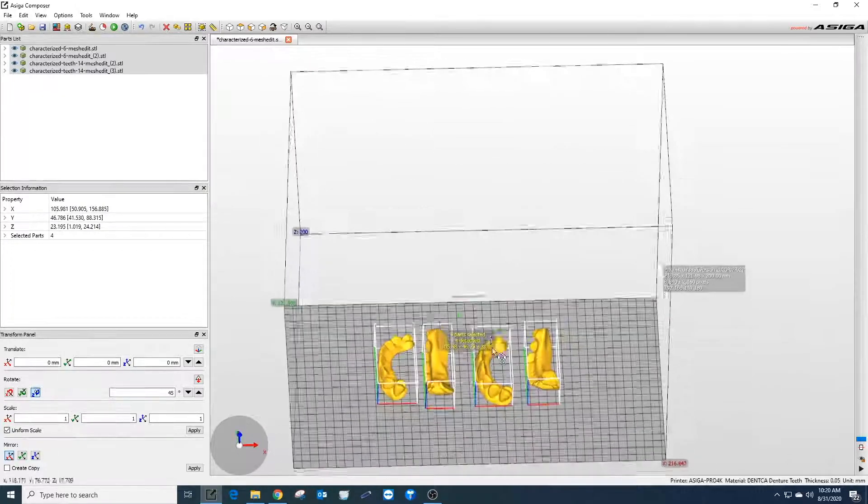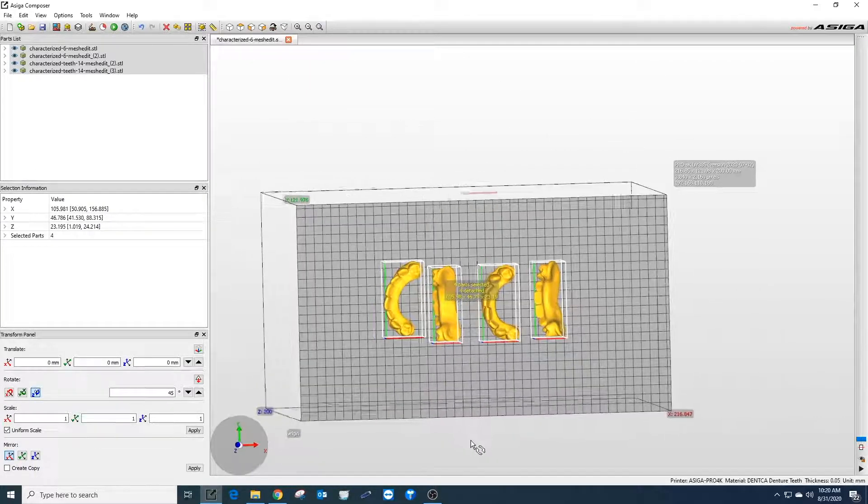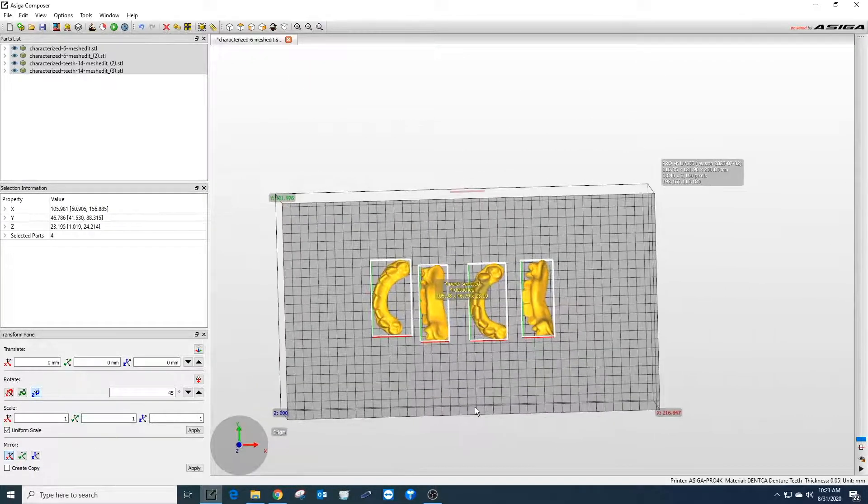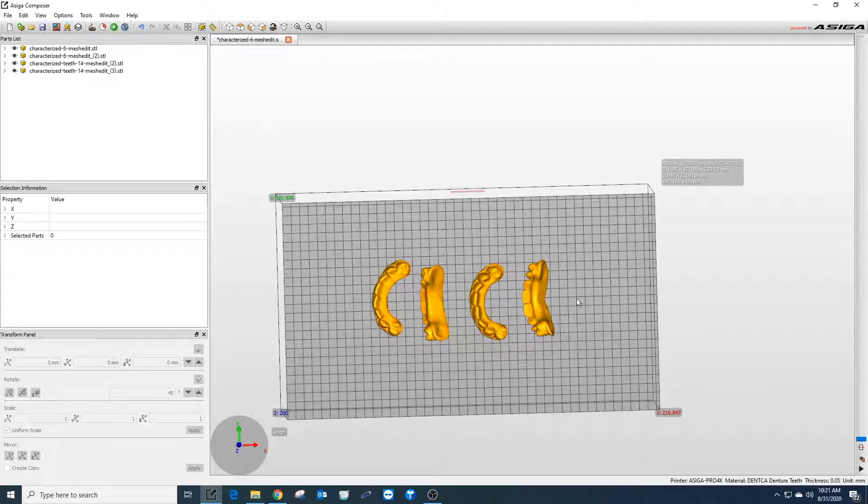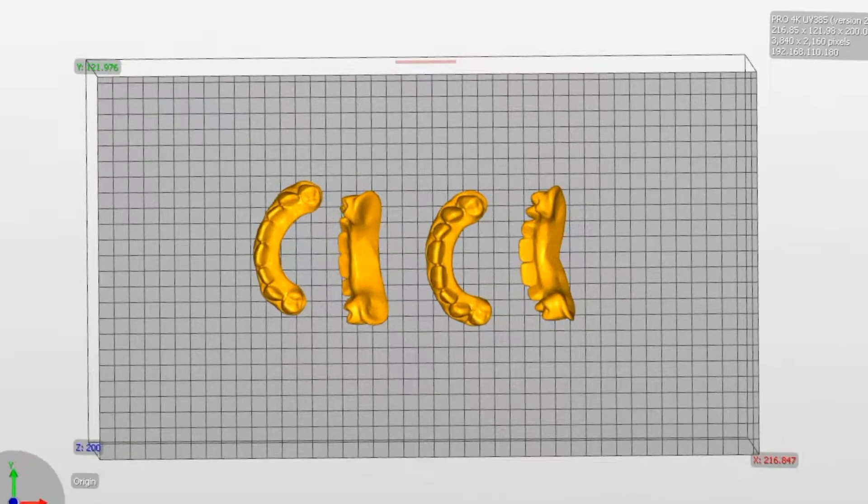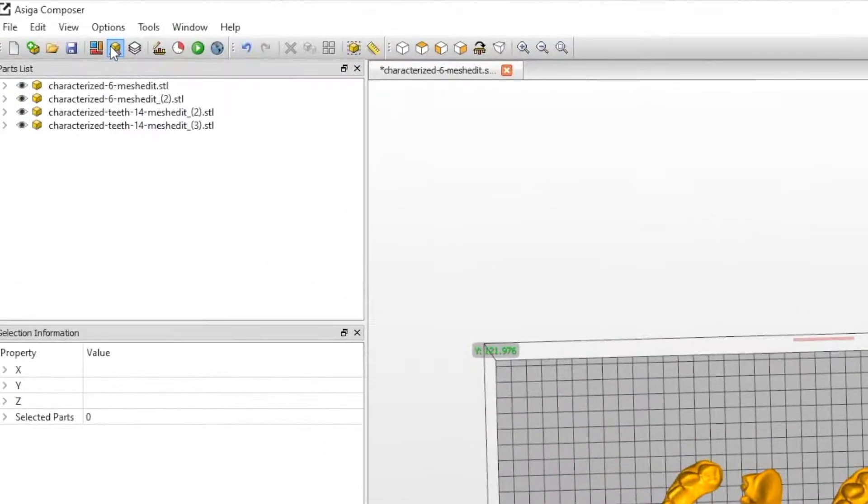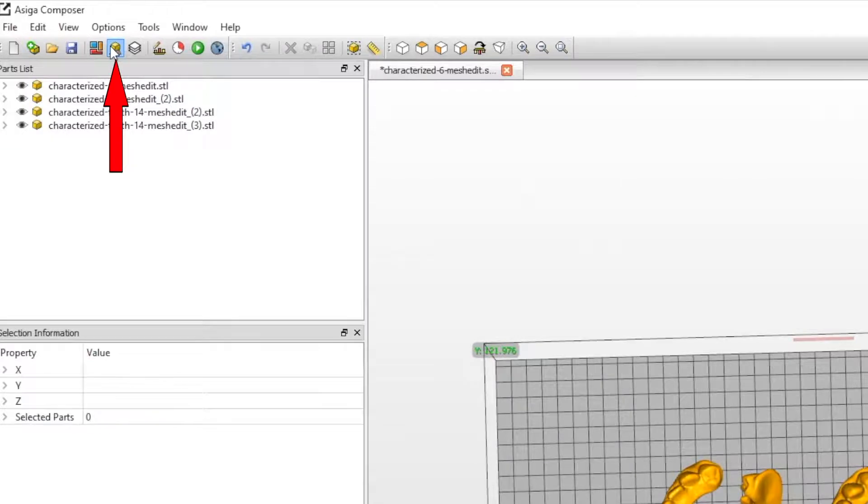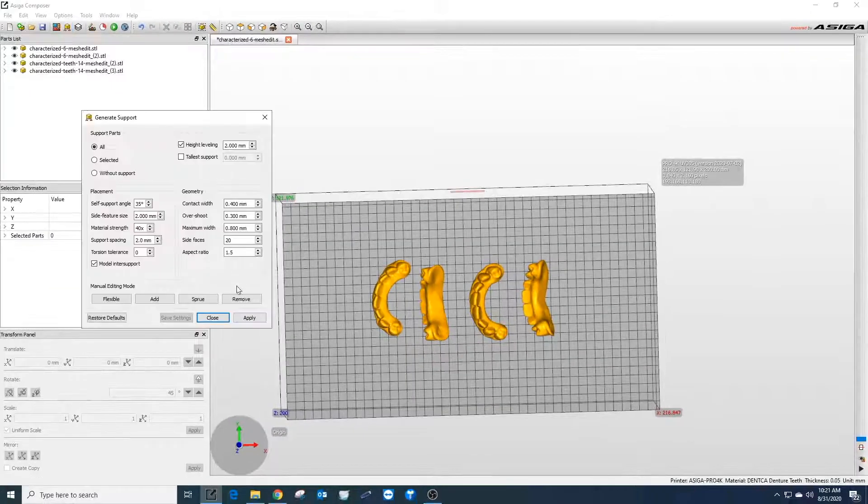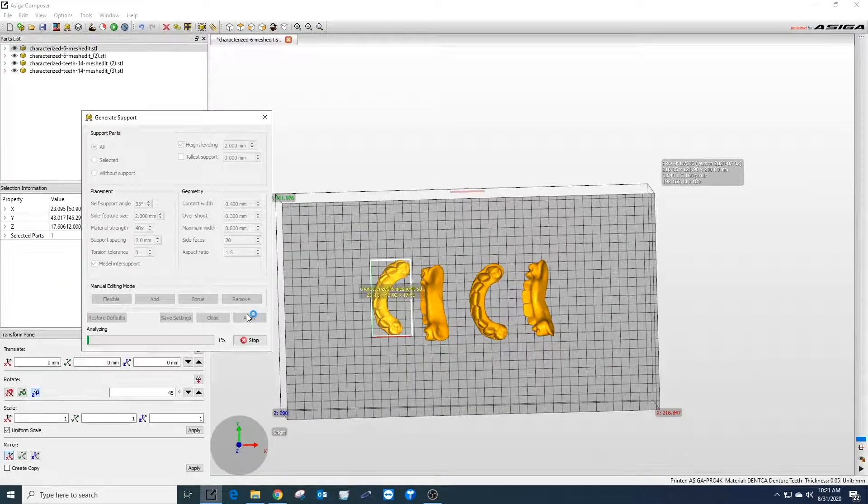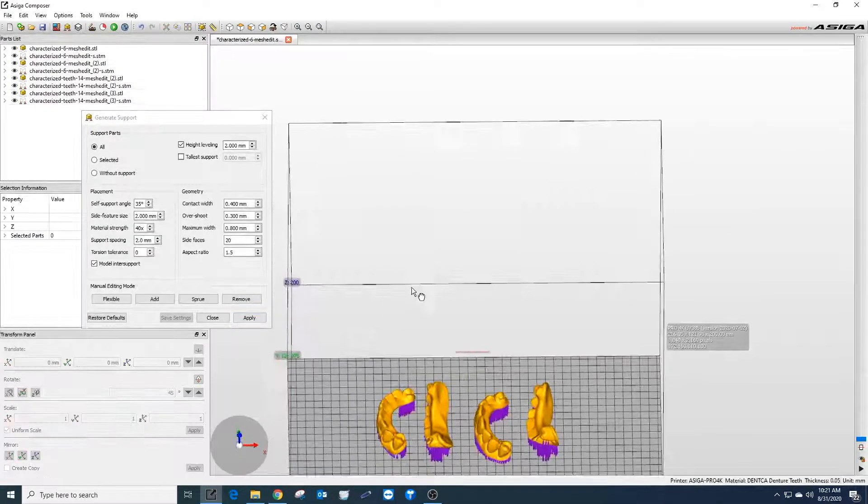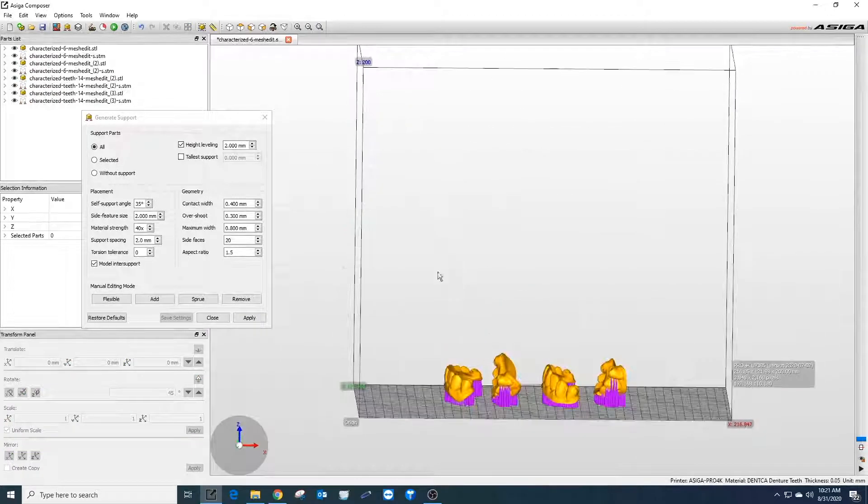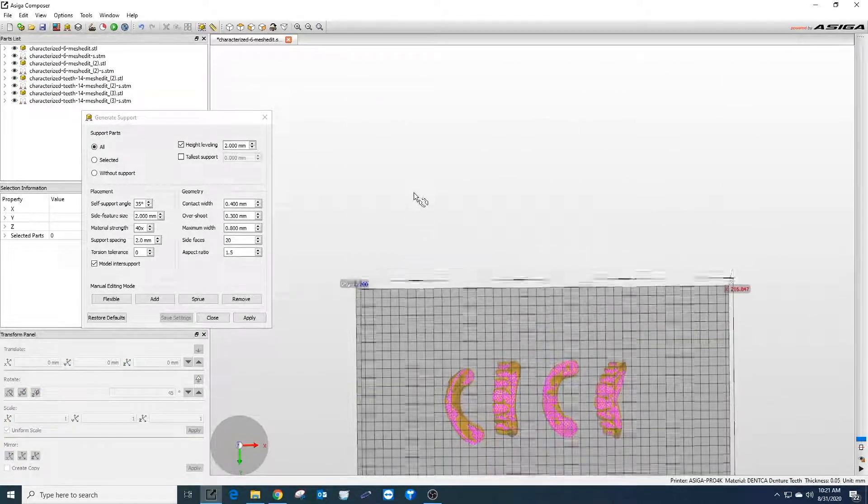Because each print may be for different purposes, they may be placed in different directions on the build plate. From here the supports can be applied. When the build objects are oriented in the correct way, select the generate supports tab in the builder menu and select apply. Once applied, the build plate can be rotated on screen to check integrity of the print.